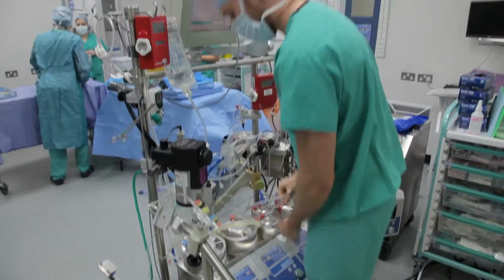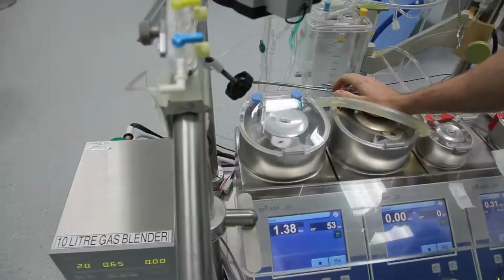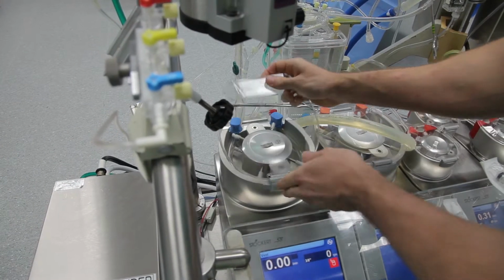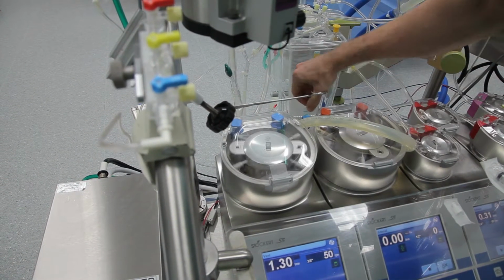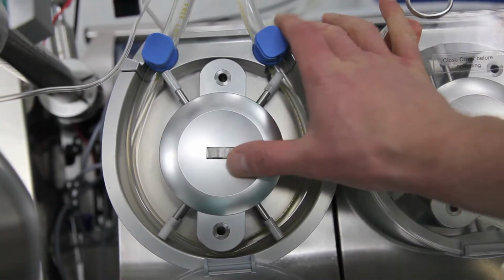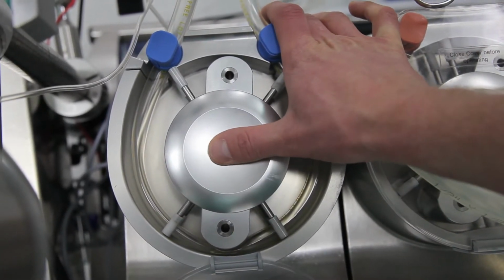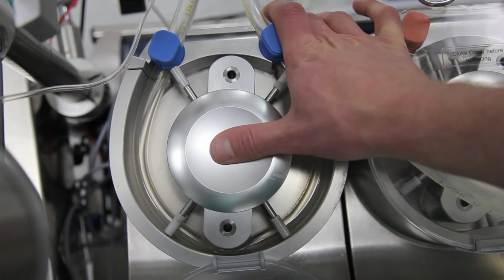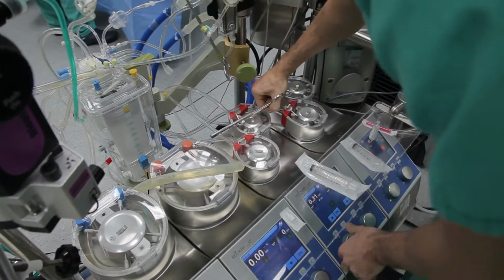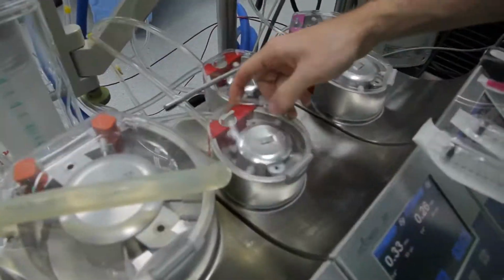While that's running in, I'll just check the occlusion on the suckers. With the suckers, you just want them to be just under occlusive, so when you've got a clamp on the inlet, they'll suck flat, but then when you stop the pump, they'll recoil like that. So that one's fine. Just do the other ones now.